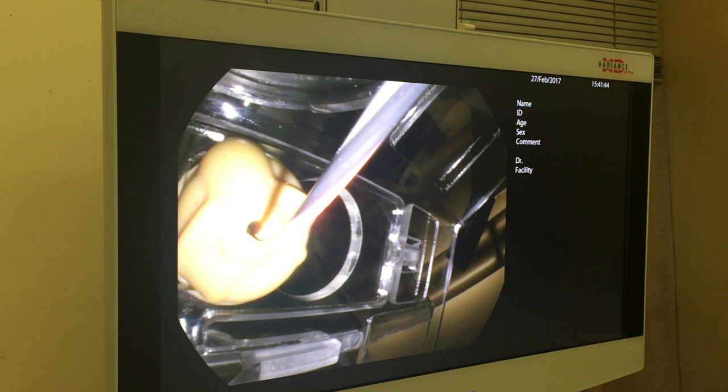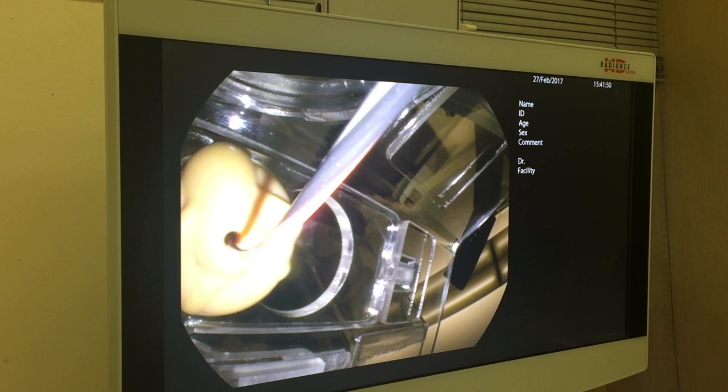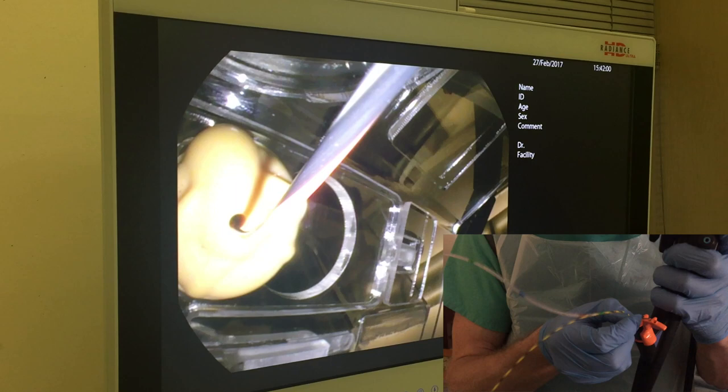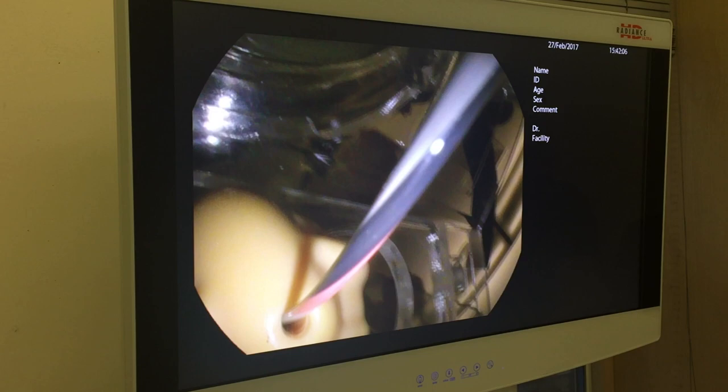So we've kept a nice stable position — slightly long and slightly to the right — and then once we come back we unlock the device, the wire is free and we can do a small staccato movement just to move the sphincterotome, secure the wire, and then we'll take the instrument off. We've done the first part of stone extraction which is securing guide wire access.